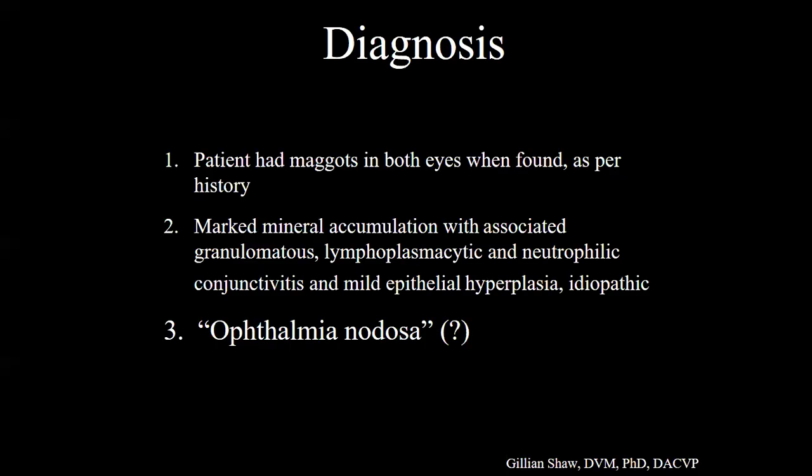Some of the linear material looked like mineralized extracellular matrix, like collagen. Yeah, it's much finer than I'd expect for elastin, which I would expect to be affected first if it was metastatic. One of the things, if you consider steroid use in general, is calcinosis cutis. I did think about that as well, but they started treating it with steroids because of a problem, so the question is, did the steroids make it worse? I vaguely thought about that, but I think I forgot to put it in my comment.